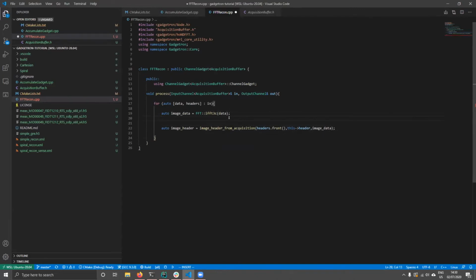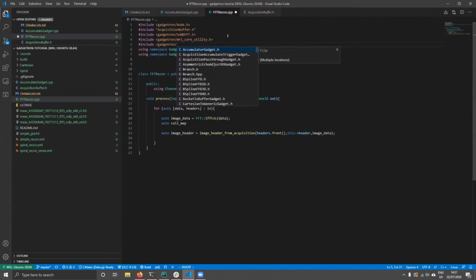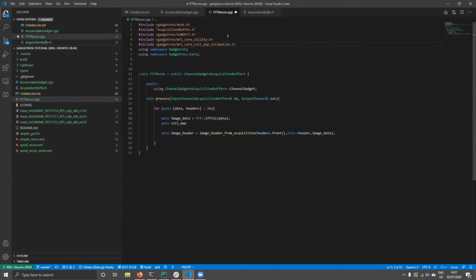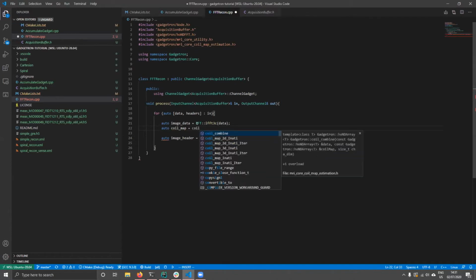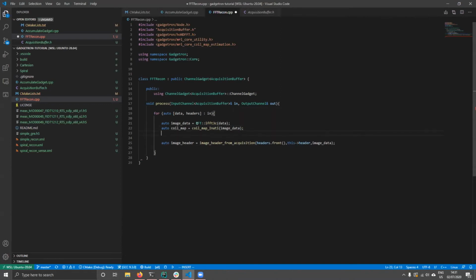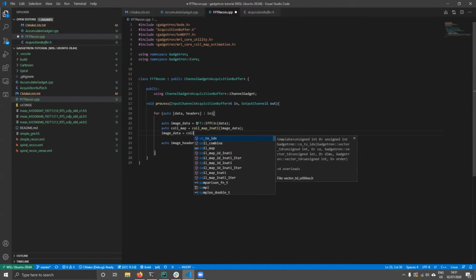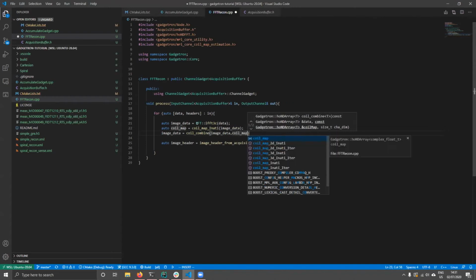Wait, we're missing something. This is not an image. This is just an FFT of the individual coils. That will not do. We want a coil map. So we can combine these images. Like we could do sum of squares, but that would be too easy and not very nice. So we're gonna do a coil map estimation. We're gonna use coil map Inati, which is using the Inati algorithm for generating coil map. And then we're gonna do a coil combination with the image data and the coil map.